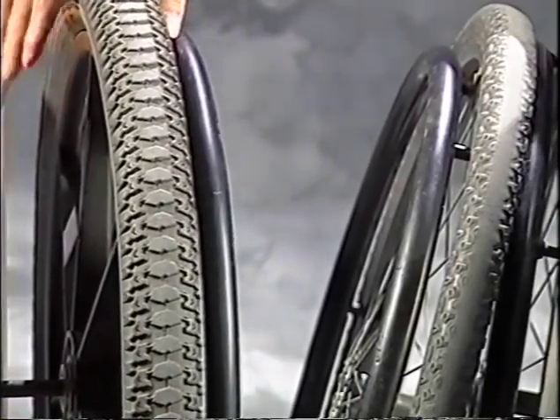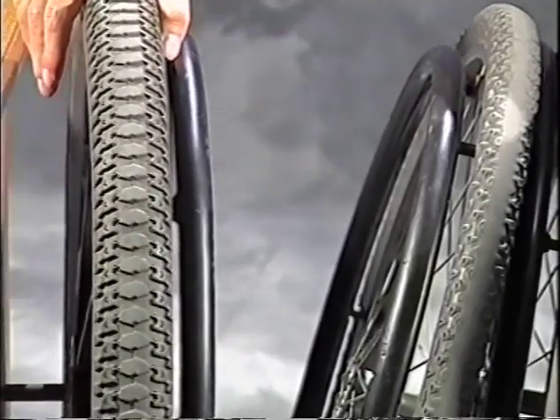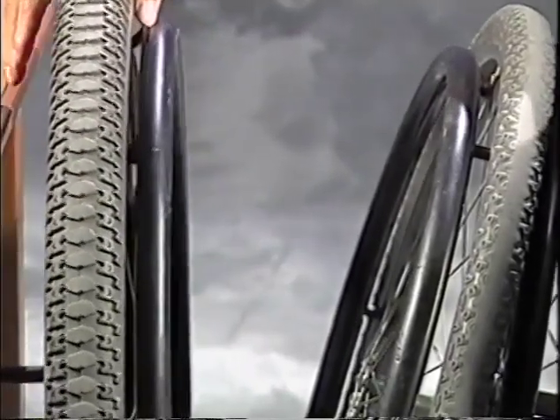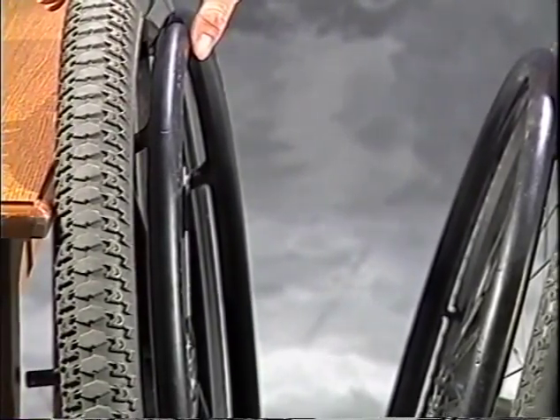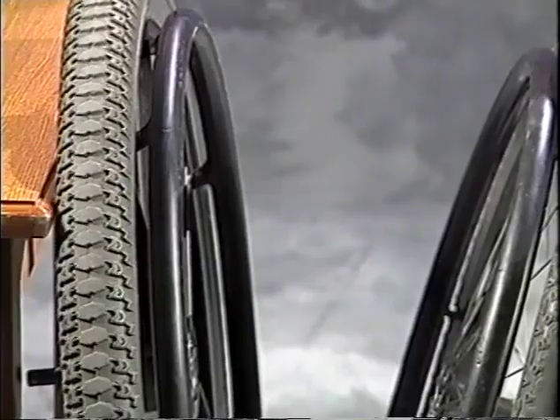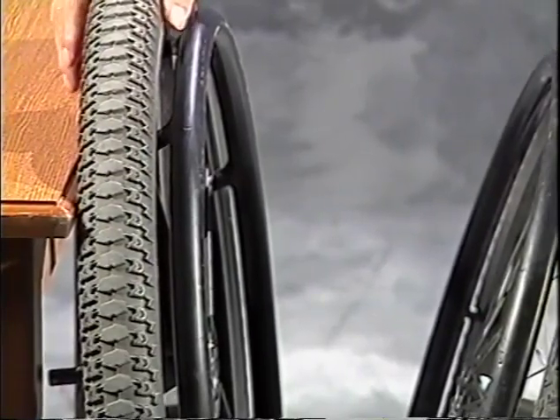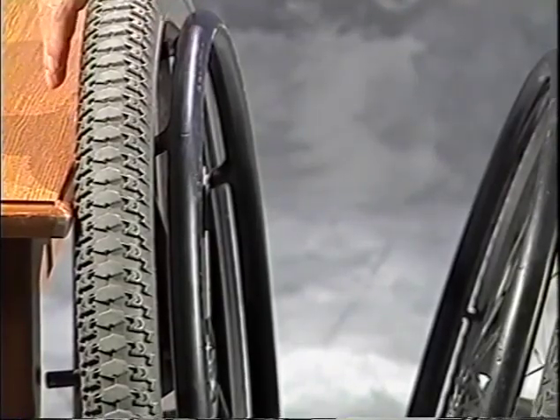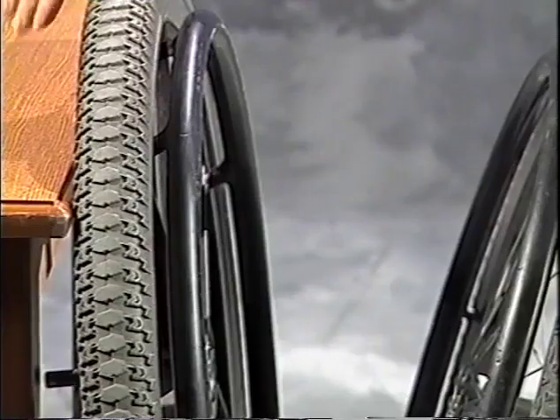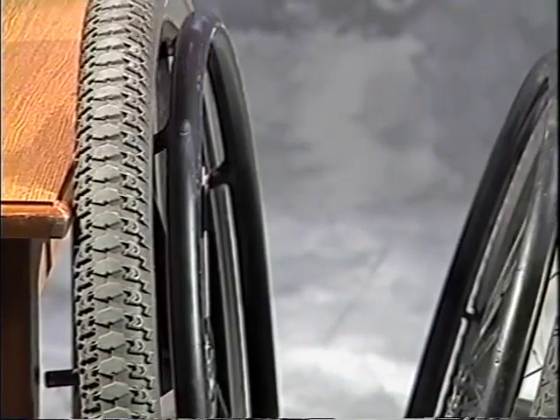The downside to this tire is that it's a very heavy tire, and the more rubber that you use or flex on the road, the more energy it takes or loses. So a big tire, good for the soft area or rough terrain. Climbing curbs, it definitely has an advantage. On the downside, it uses more energy for everyday rolling around.